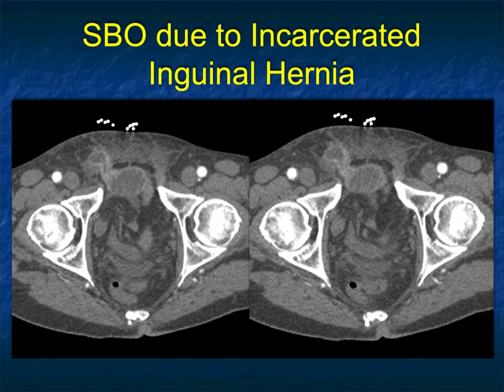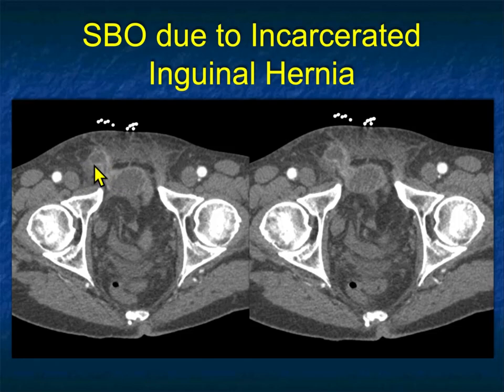Looking at the axials, just a beautiful example of how the bowel loop is enhancing — so it's inflamed — with fluid around it going right into this hernia sac. A very nice example right there.